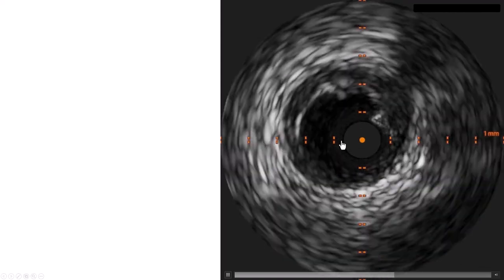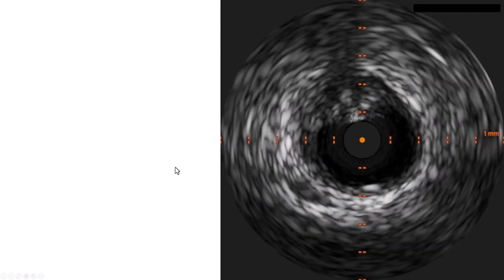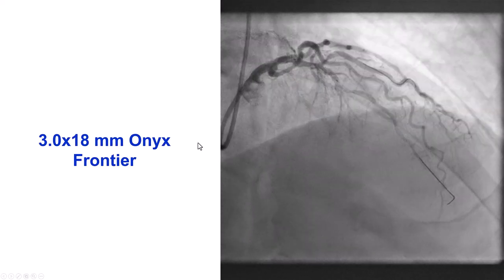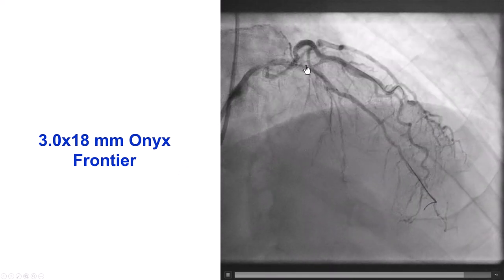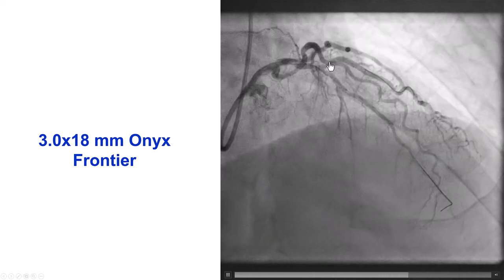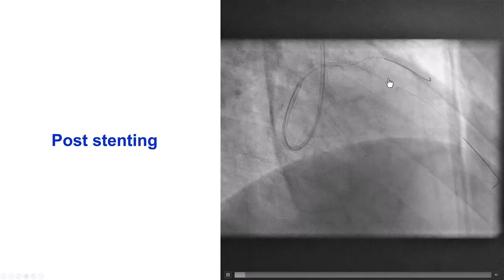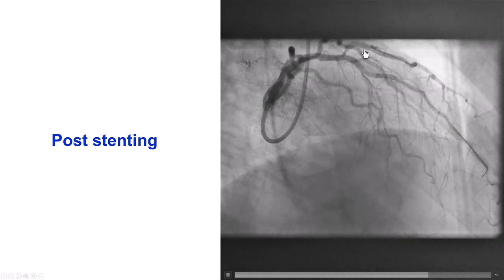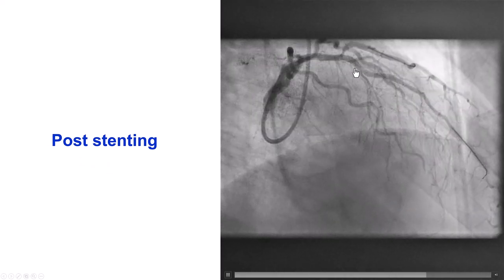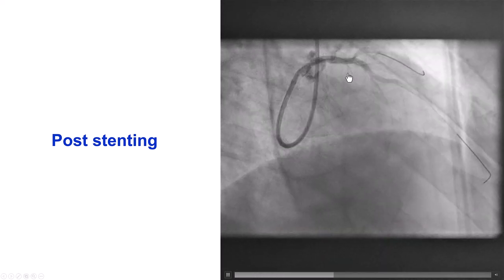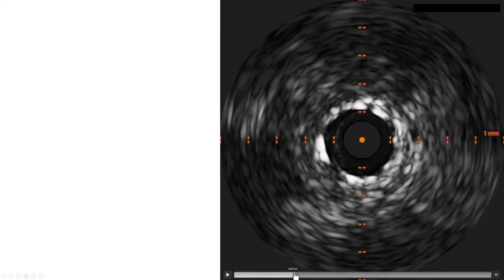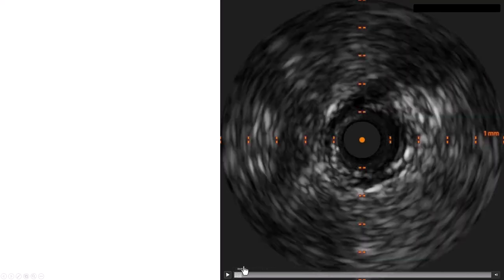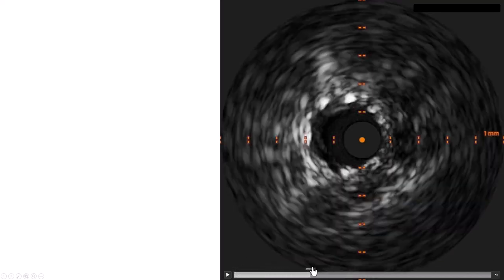Based on the IVUS and angiogram, we decided to proceed with provisional stenting. This is a 3.0 by 18 mm Onyx Frontier deployed across the origin of the diagonal. We jailed the wire in the diagonal. After doing that, we still have flow in the diagonal; however, the lesion at the origin of the diagonal may seem a little worse. There is also some ambiguous area distally — maybe some distal edge dissection. Another intravascular ultrasound demonstrated some diffuse disease distal to the stent, but the stent appeared to be well expanded.